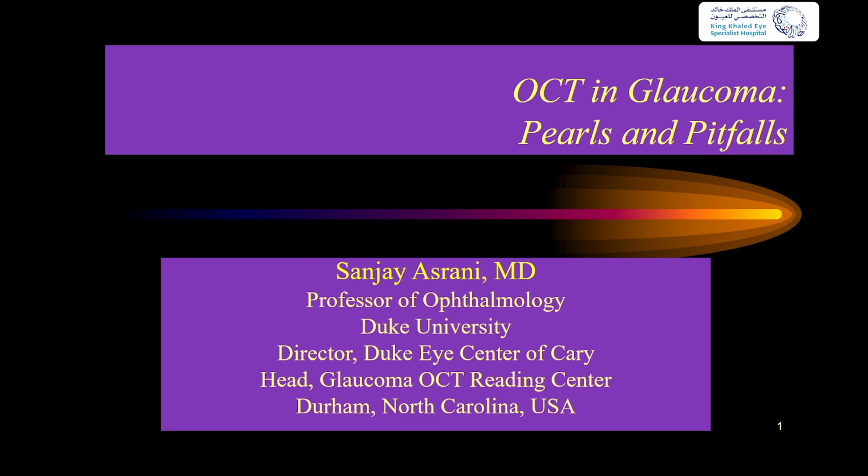So there should be a loss of at least 15 microns in 15 years, right? No one has ever done the study. All studies are cross-sectional. The longitudinal studies are only 3 years. In 3 years, you can't make out. All that you're seeing is artifacts. It's just inter-measurement variability. We have just finished looking at the last 80 patients who have been followed for 15 years, from 2010 to 2025.